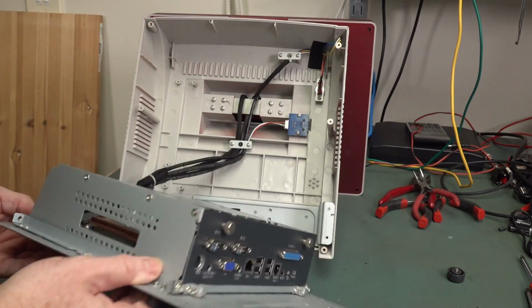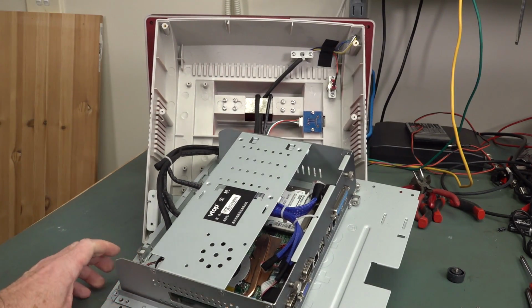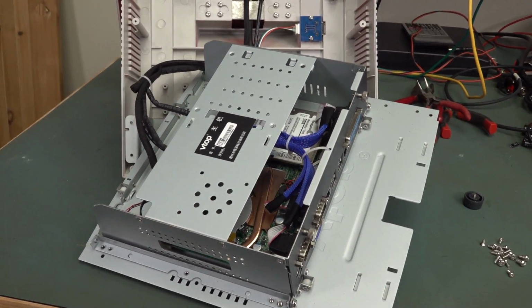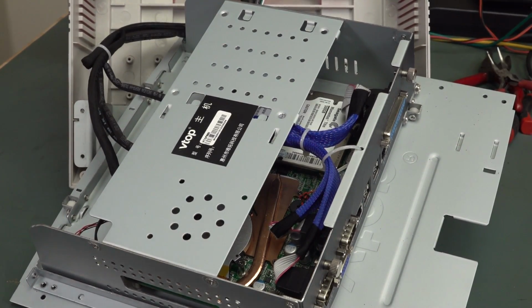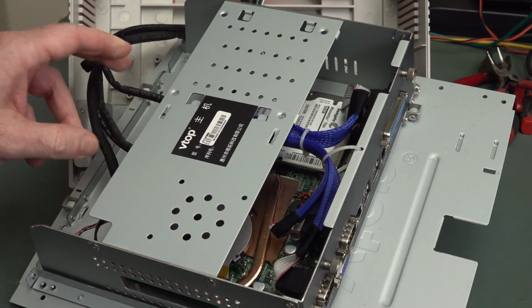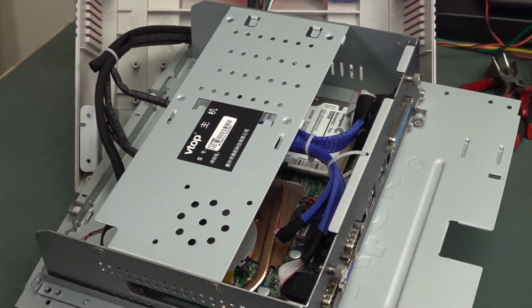There we go. That is going to come out nicely. We're in like Flynn. There you go. It's an open frame jobby. That's interesting. It's not something that you'd readily expect. I expected a little small form factor, one of those small form factor cases. This looks almost like a custom designed case. If anyone's seen anything like that before, please let us know. But that's fascinating. Anyway, it's all nicely cable tied and heat shrunk and everything else.